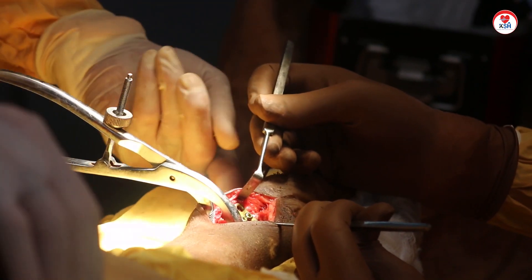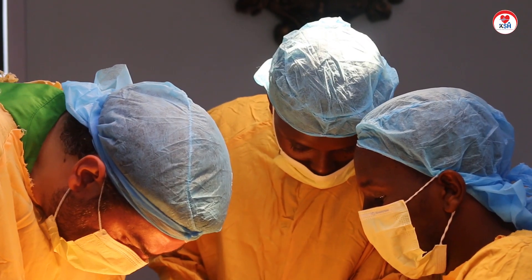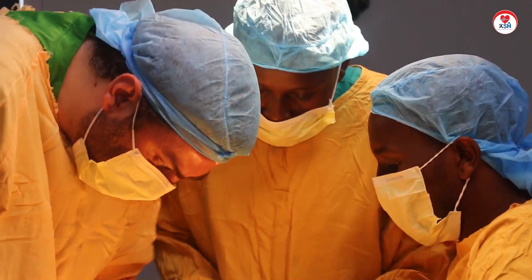We have today a case of bilateral bones of the forearm fracture with malunion — an old fracture from two months ago with malunion in the forearm affecting the wrist joint and movement in the wrist joint. We performed an operation with osteotomy and refixation using two plates and screws for both bones, achieving 100% reduction under general anesthesia.